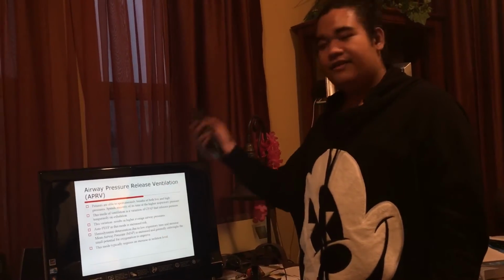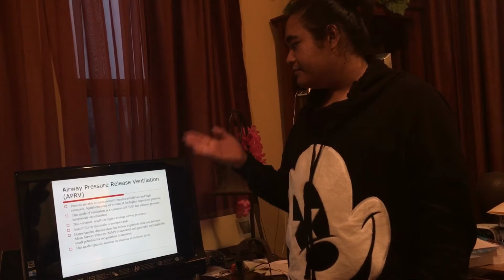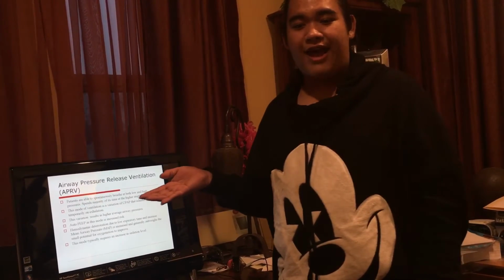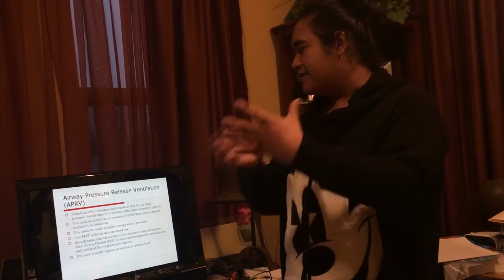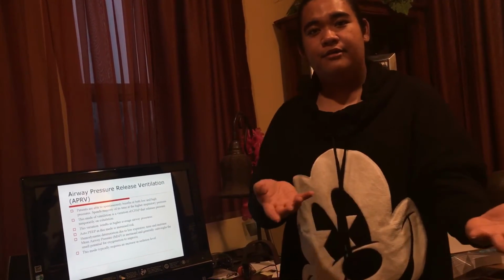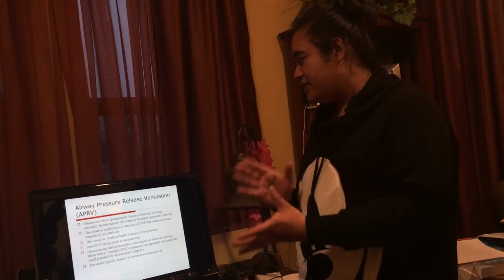I'm not going to go over all of this information, but basically APRV is more of a variety of CPAP. There are different kinds of CPAP pressure that it can give, so there's a variation of it.